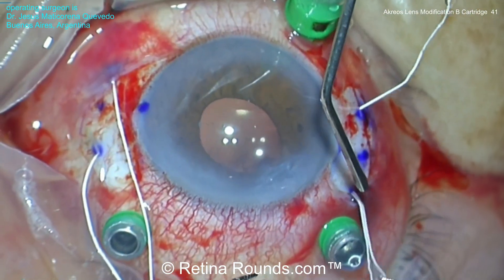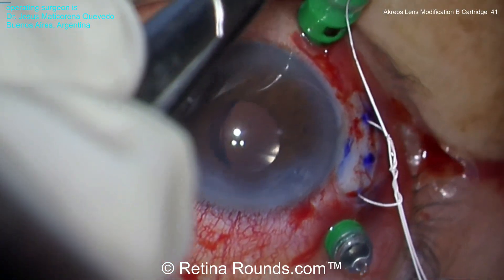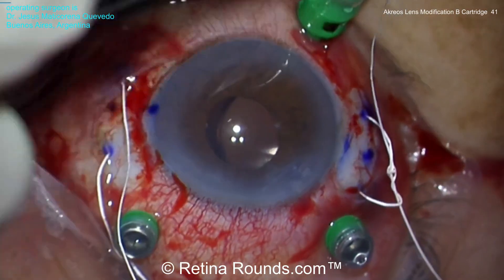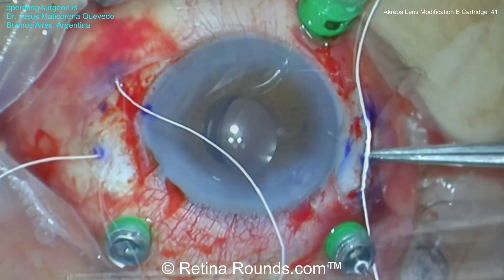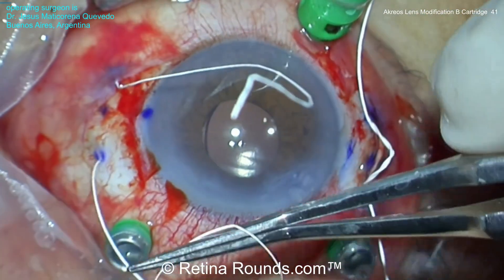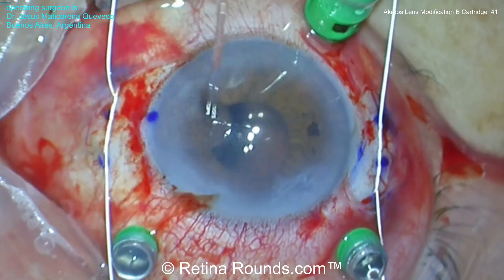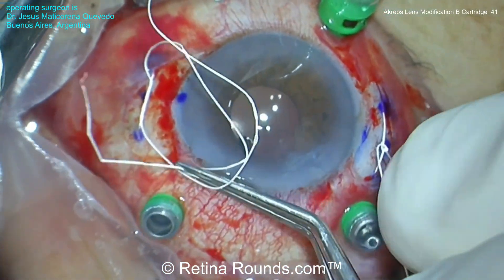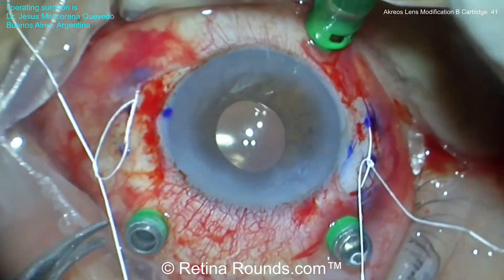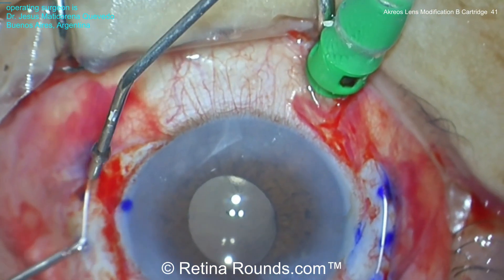Once the Gore-Tex sutures have been externalized, the lens can be secured in place. Using a 3-1-1-1 suture, first the 3 placed loosely to properly center the lens. You can see that's done on both the temporal and nasal aspects. Once the lens is properly centered, the lens can be locked into place using two additional throws of the suture. The knots of the Gore-Tex suture are then internalized into the pars plana through the sclerotomy.